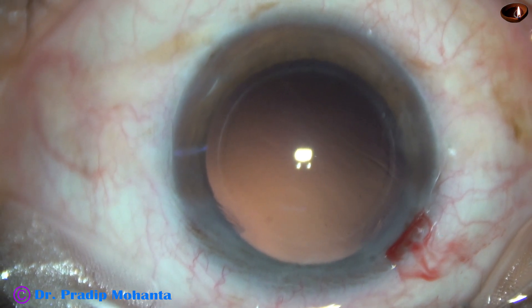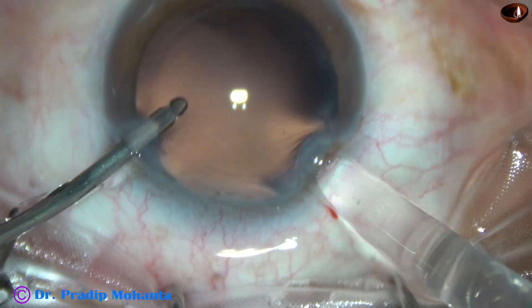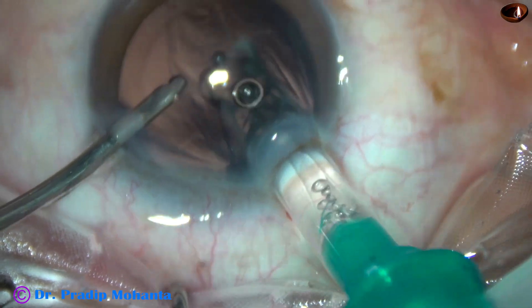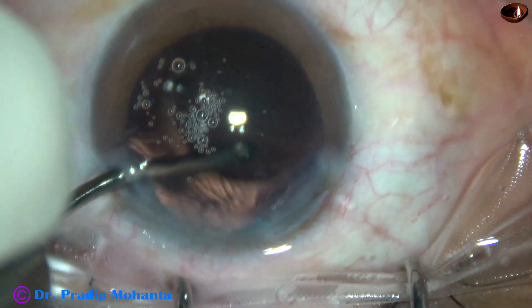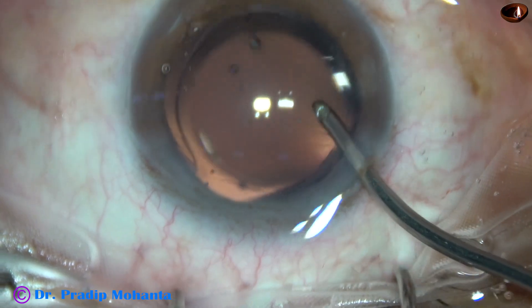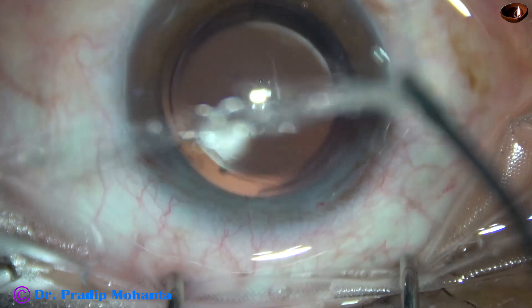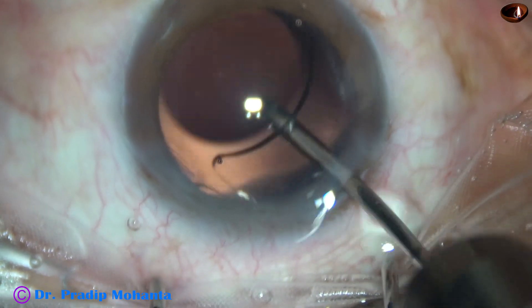Now, hydro-implantation of a single-piece monofocal intraocular lens. And this lens opened very abruptly. The material is said to be hydrophilic acrylic, but it is opening very abruptly. The lens is in the bag.